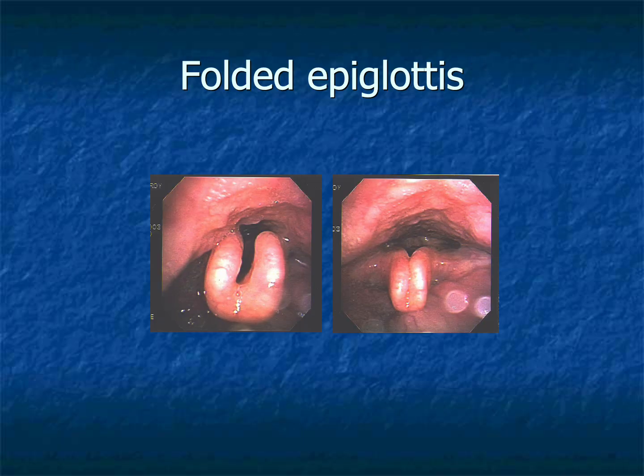Here we see a folded epiglottis. Some anatomic variations are incidental. Others contribute to symptoms or altered airflow dynamics. The challenge for the bronchoscopist is determining when an abnormality is clinically meaningful and when it represents a benign variant. This distinction requires judgment, not merely recognition.